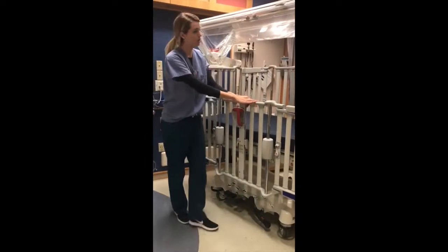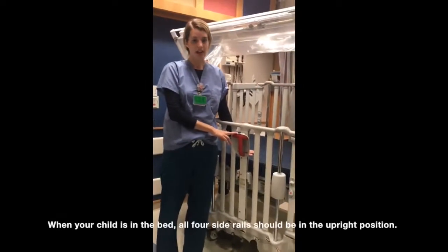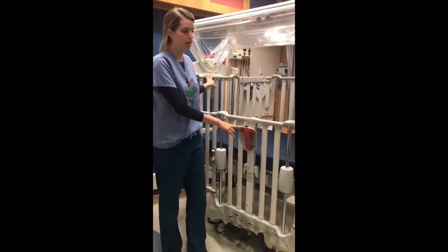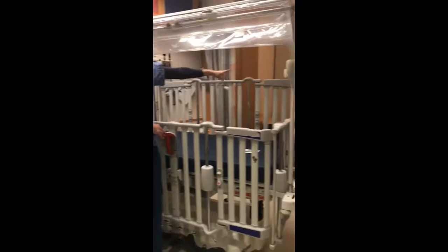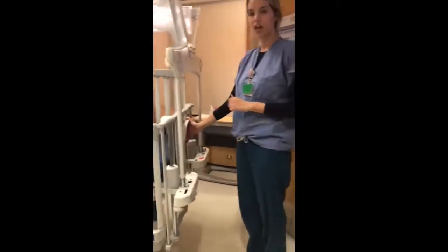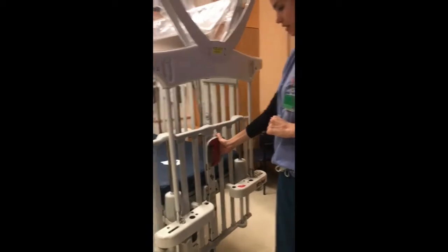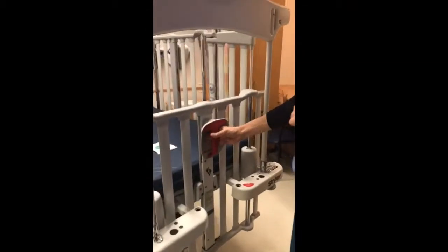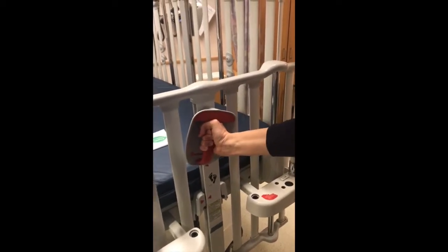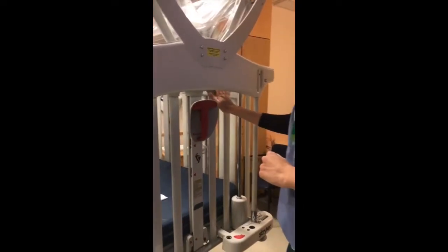Now I will show you how to operate the four side rails of the bed. We want to make sure that when your child is in the bed, all four side rails are in the upright position — one at the head of the bed, one at the foot of the bed, one at the left and one at the right. To operate the side rail, use the hand lever on each side rail — it's red. Squeeze the trigger towards your hand and rotate the handle to either the right or to the left, and slowly raise the side rail up. Always push down to make sure it's in the locked position.